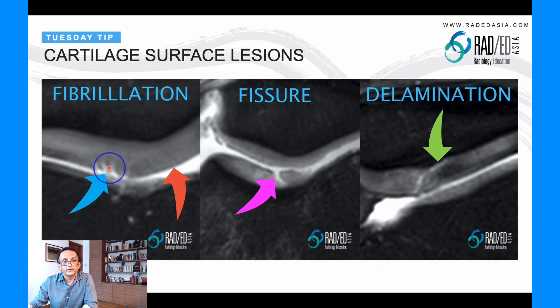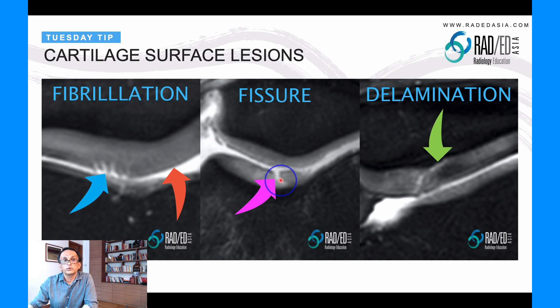As it gets more severe, we get fissuring, and fissuring is deeper. It can go either down to the cortex, or it can go to variable depths. But it's deeper and wider, and it's just a bit more substantial than surface fibrillation.